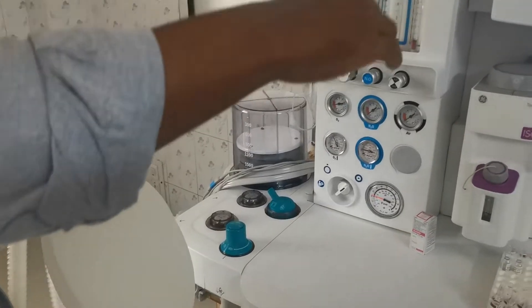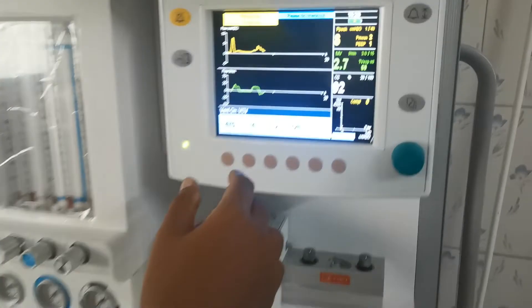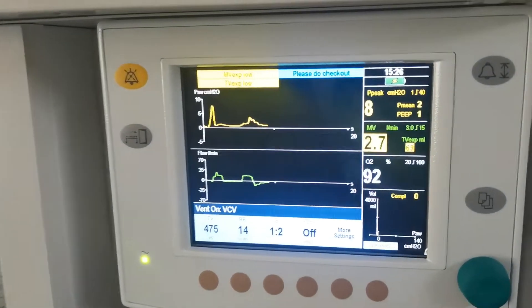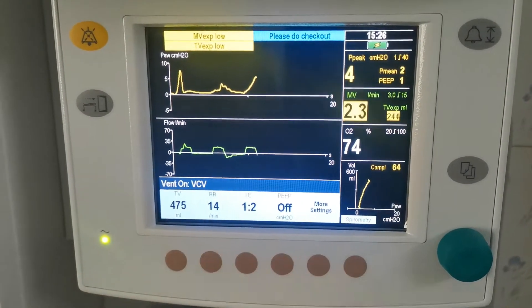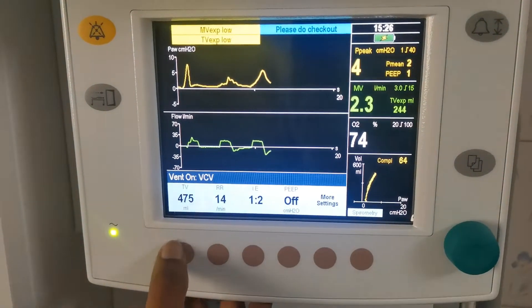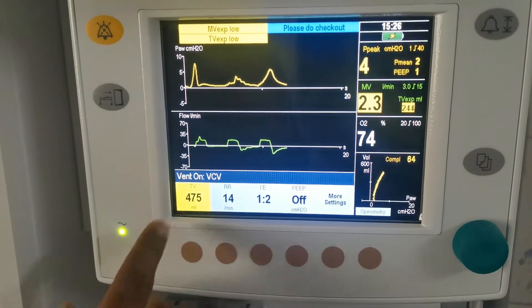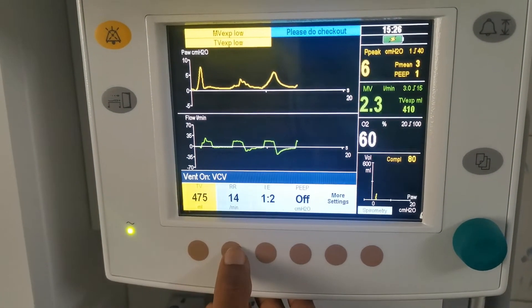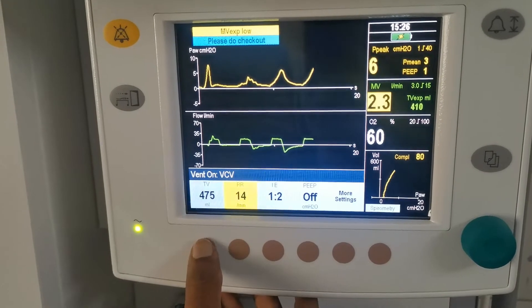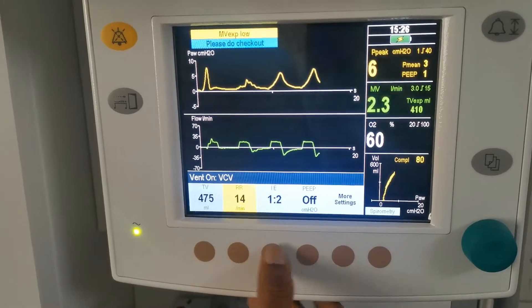Now you can come to the screen. We have settings for tidal volume. We have the settings for tidal volume, respiratory rate.